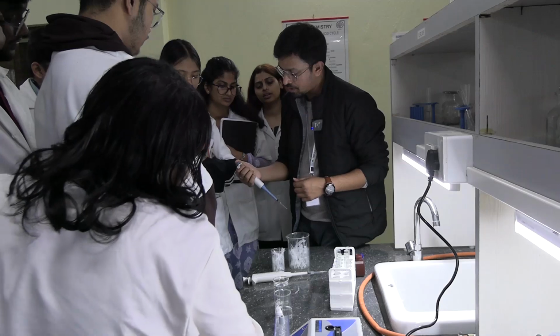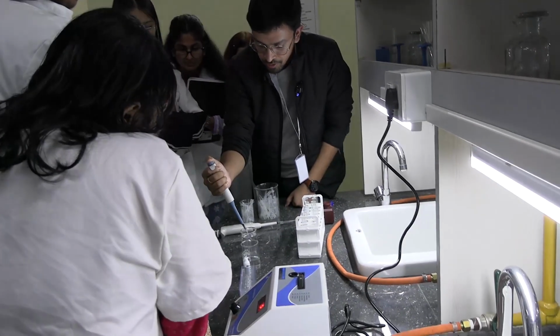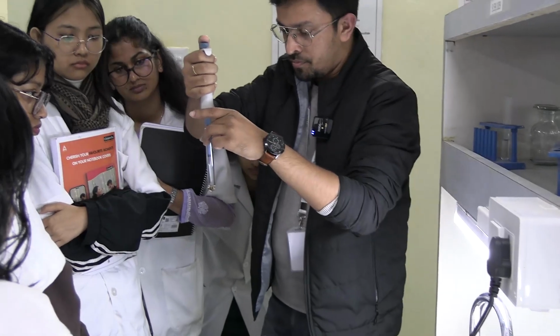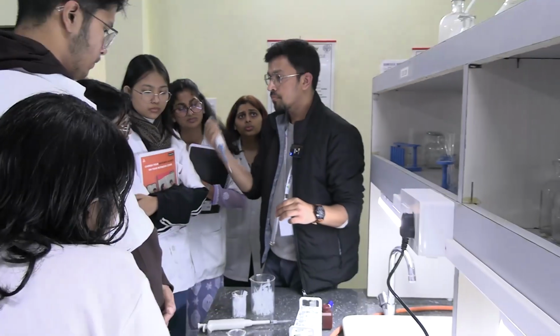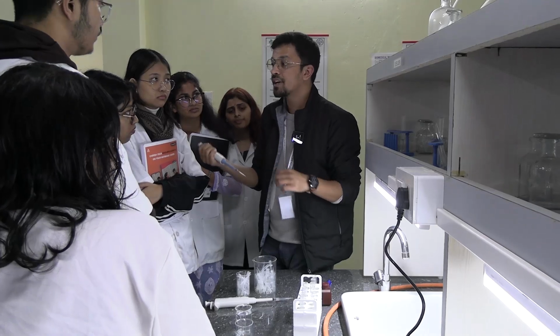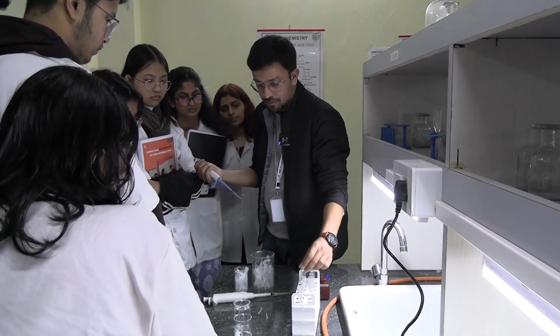Take the pipette. Okay. This much. I'll put in the distilled water. Take the sample. See? Deep inside the test tube. Release it. That is why if you are doing the wrong process, you will get the wrong values because the amount is very less. Okay, so our blank is done. I'll mix it and I'll keep it over here.